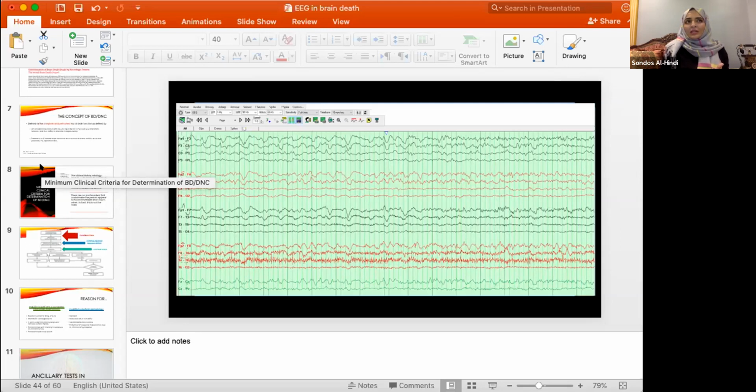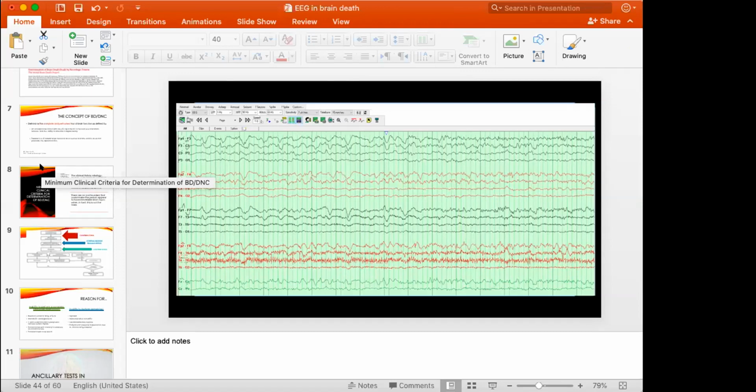But for brain death, you don't really need it, and you won't be able to use, let's say, a single electrode or quantitative EEG because you have to follow a strict guideline protocol. So to my knowledge, there's no role for it, and I haven't seen any reports of people using it. Maybe it didn't come up in my search. If you're aware of anything, I would be happy to know about it. But to me, there's no role for it.